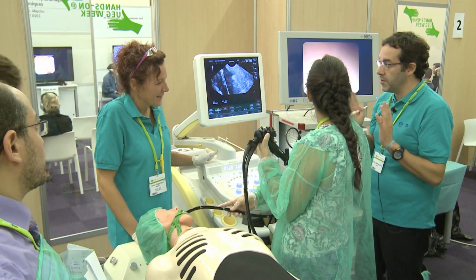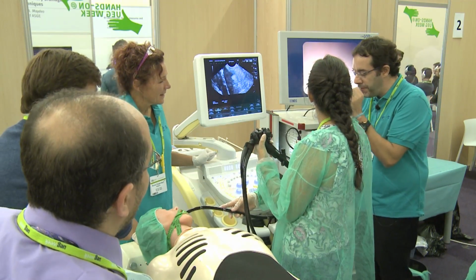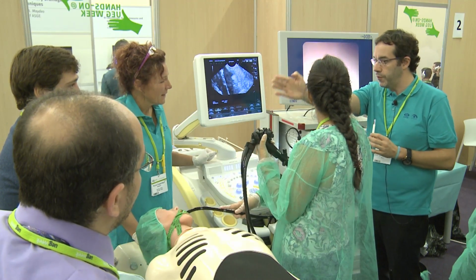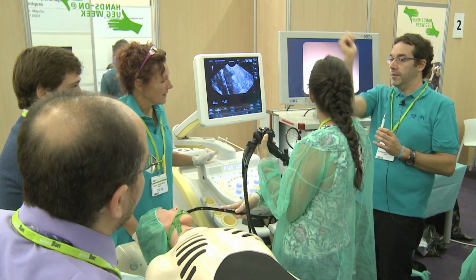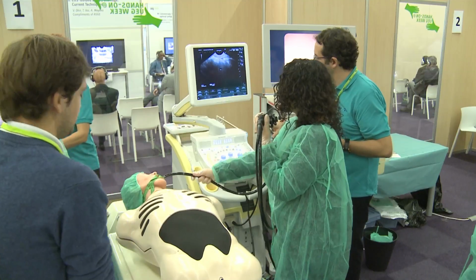This is very important because you may have some problems in imaging and in orientation. There are a few moments when you need endoscopy just because you are not looking to the front. You are looking a little bit up. That's the difference from ERCP, where you are looking up completely.